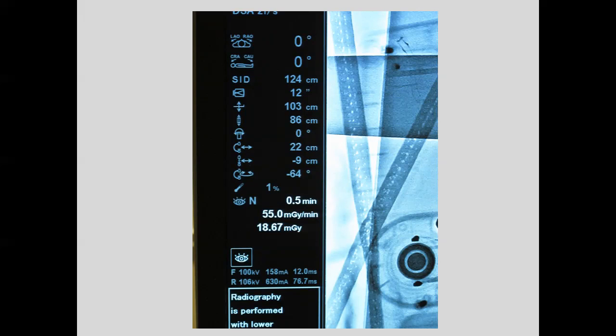You have a display. If you have a 52-inch display, it can actually be one of your screens. As soon as you step on fluoro, you're going to see a little line go up and tell you how much radiation you're getting right now. So it's going to be an interesting tool to have.